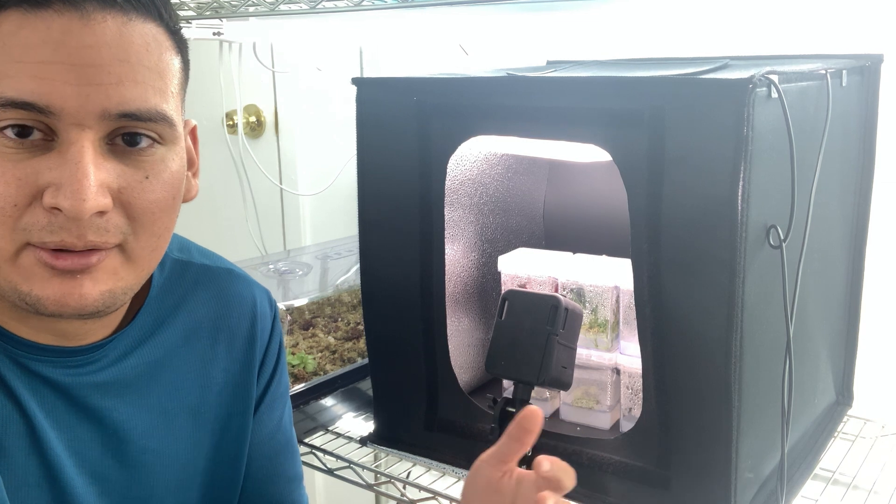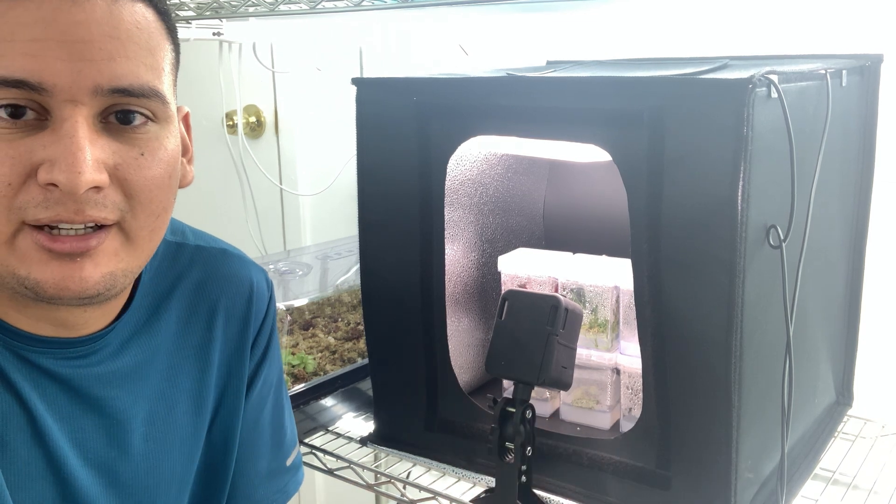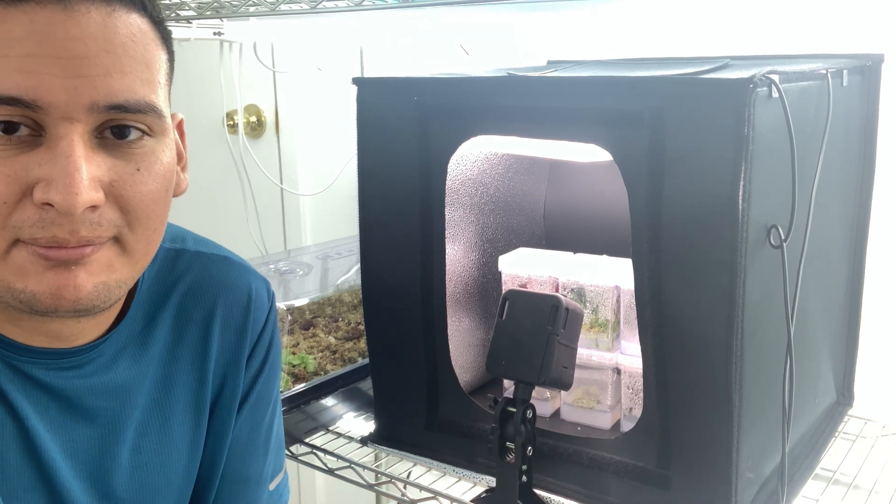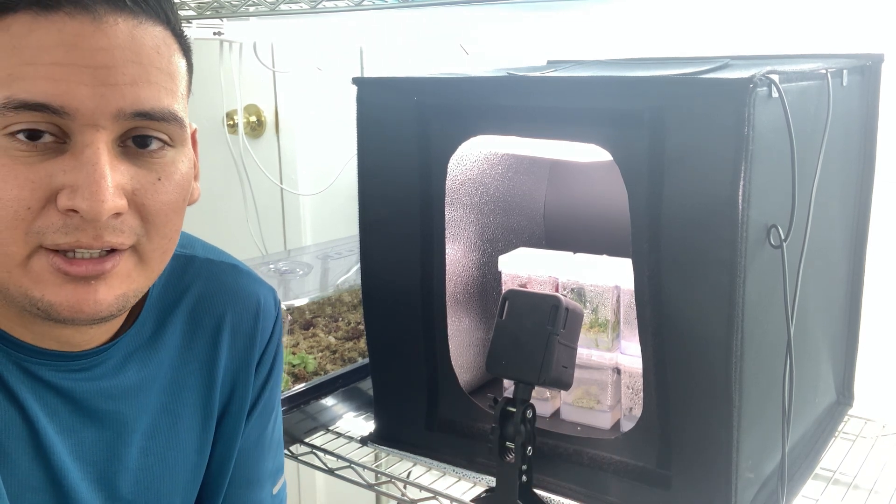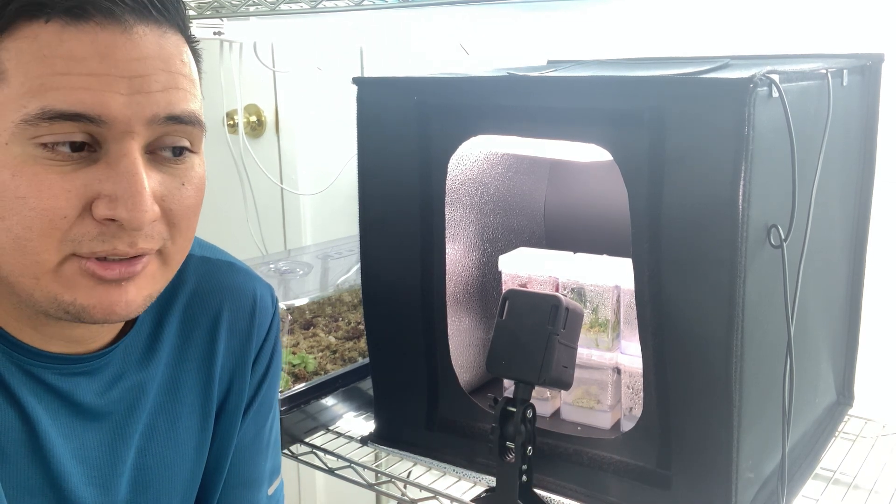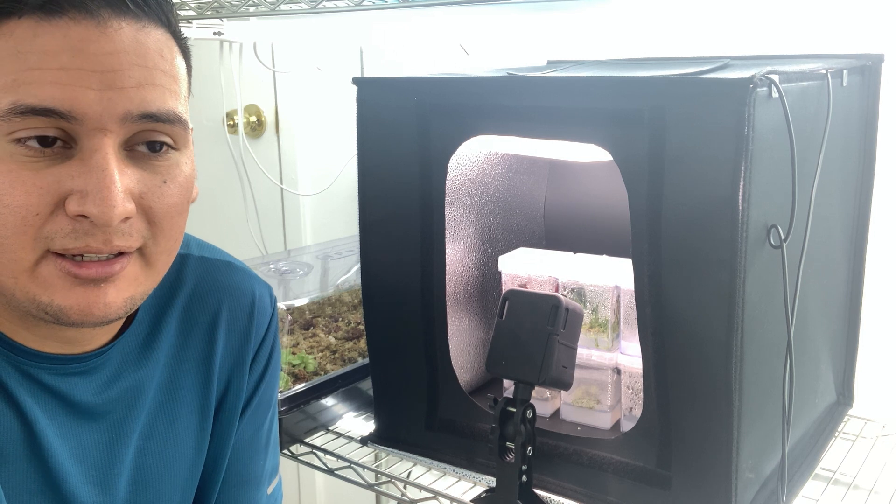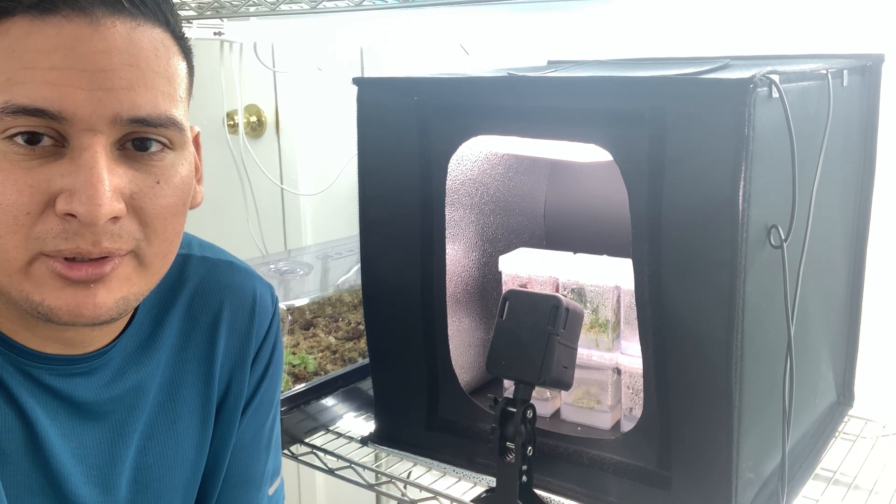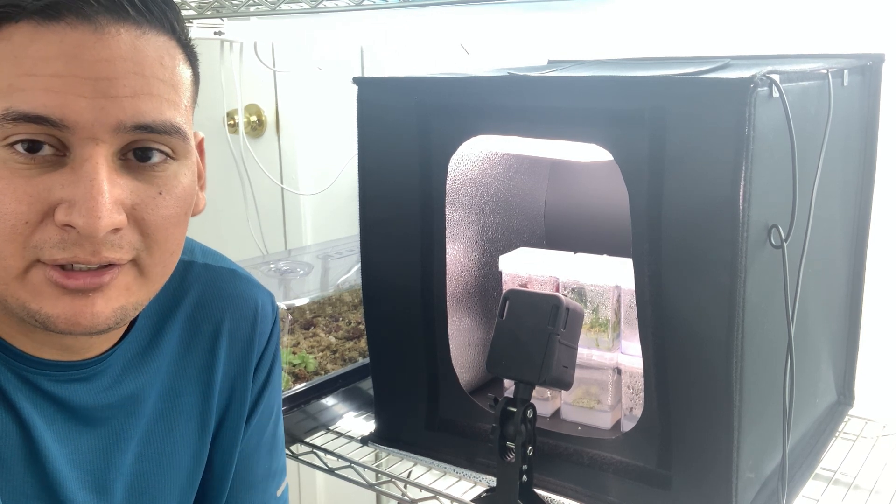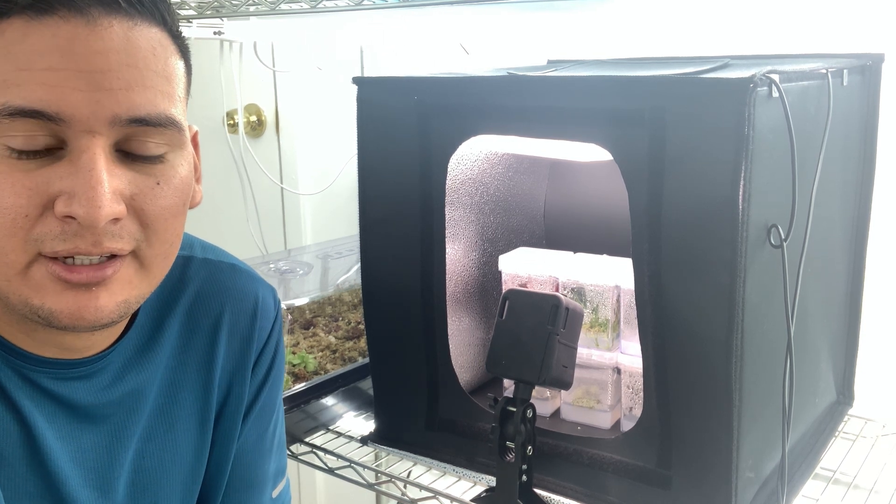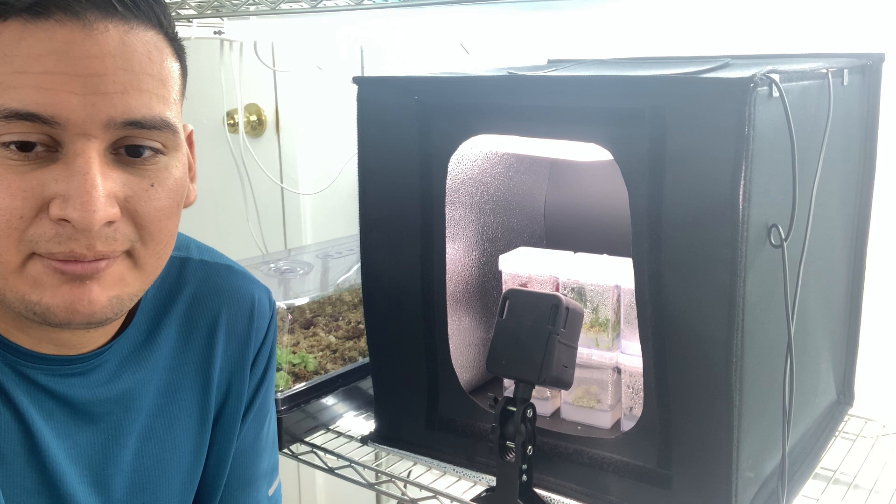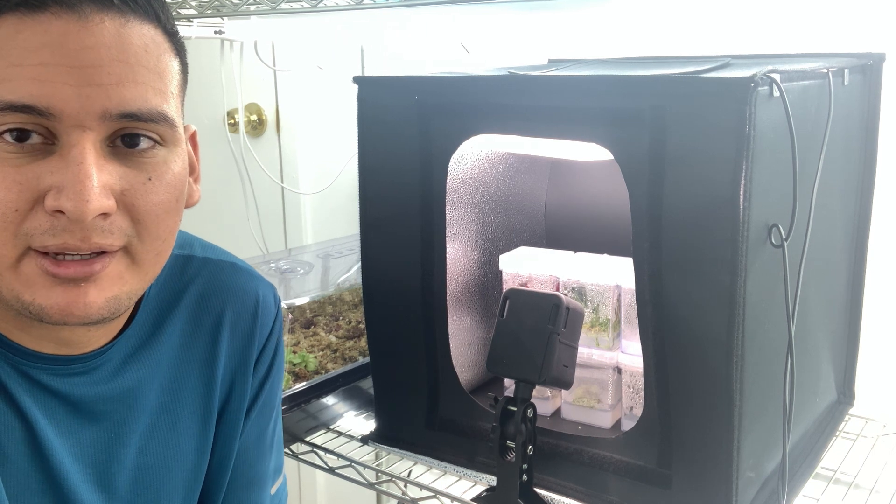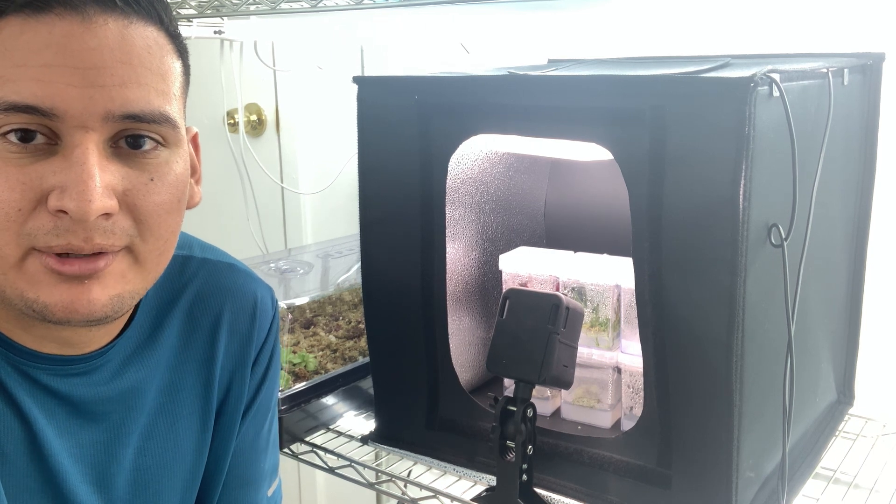If there is any contamination, it will be because it was not sterilized at the beginning. So that's pretty much everything. It's going to take me maybe one or two weeks to see if there is any contamination, and I'll make an update video.